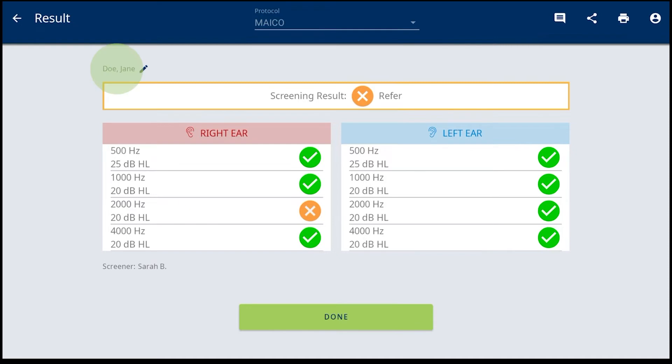The subject name, as entered, with the option of editing when the edit icon is shown.